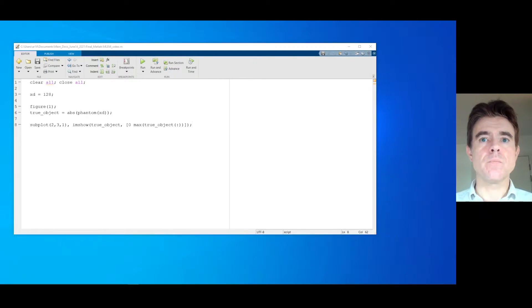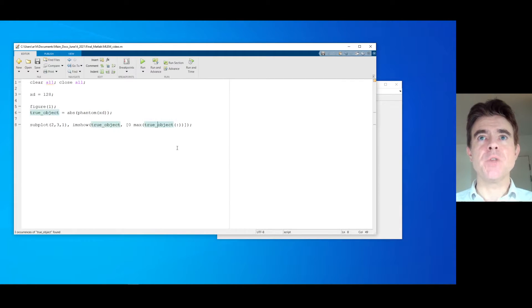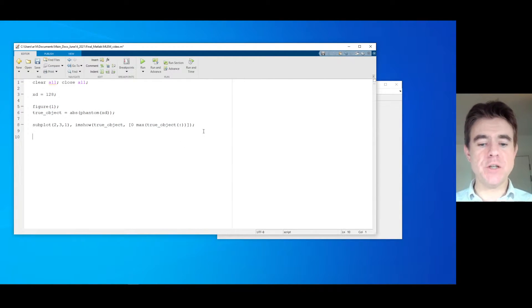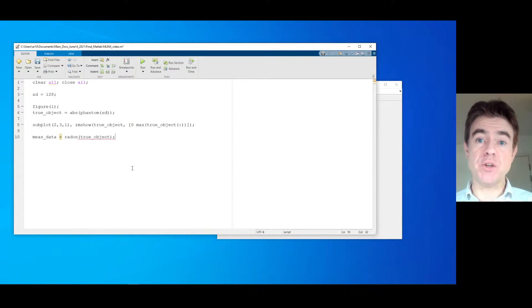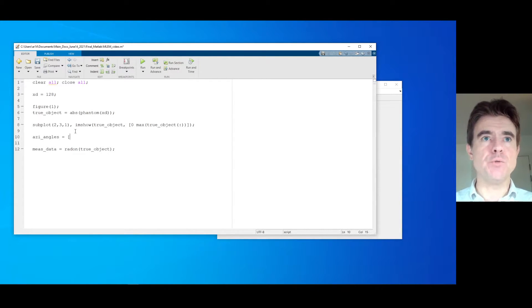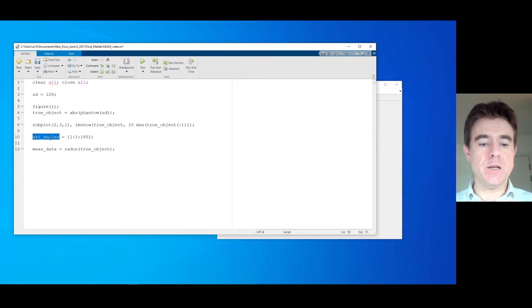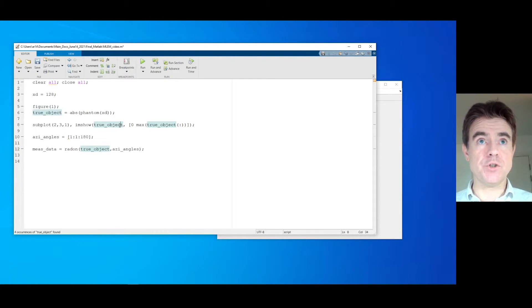Let's run that. The figure is just coming up — that is showing the true object. Now we're going to generate some artificial measured data. Measured data is going to be the forward projection along line integrals, so it's just the Radon transform of that true object. We need to specify which angles we want to forward project into — I'll call those azimuthal viewing angles — between one degree and 180 degrees in one-degree increments.